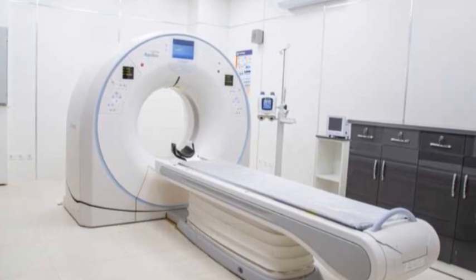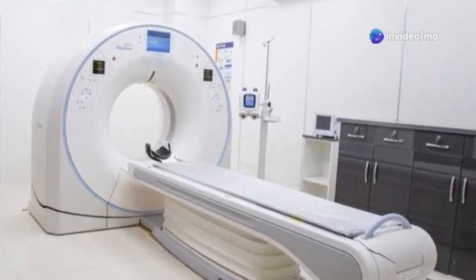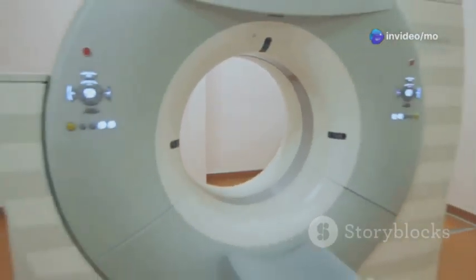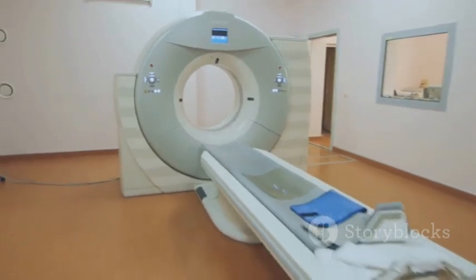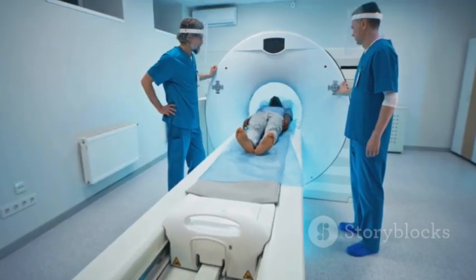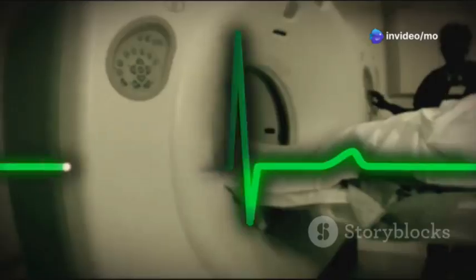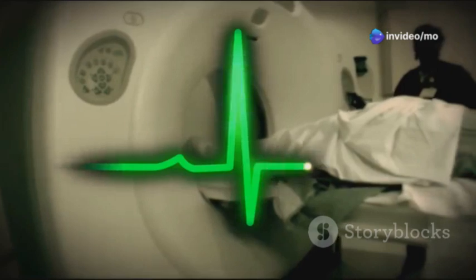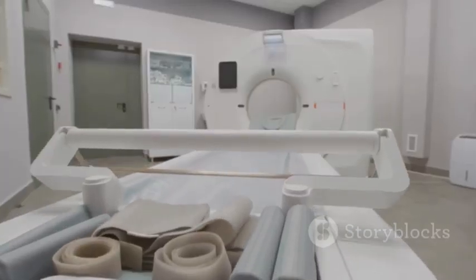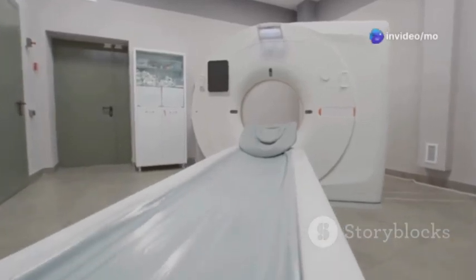Over the years, CT technology has advanced significantly, leading to the development of faster and more sophisticated scanners. One such advancement is the helical CT scanner, also known as a spiral CT scanner. Unlike older sequential CT scanners, which captured images one slice at a time, helical CT scanners employ a continuous spiral movement of the X-ray tube and detectors around the patient. This allows for much faster scan times and the acquisition of thinner slices, resulting in more detailed images.